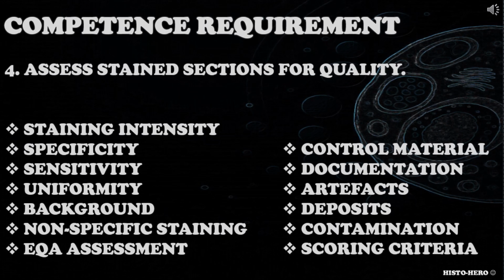The fourth competence requirement is assess stained sections for quality. Candidates should be able to assess quality of stained sections. Does the candidate assess stained section for quality correctly? Do they take correct steps during the assessment? Do they focus on correct features when assessing quality of staining?